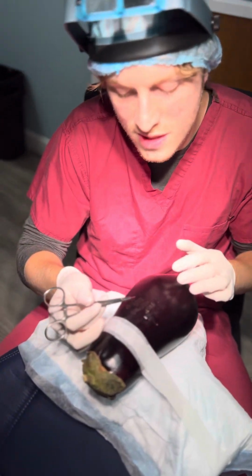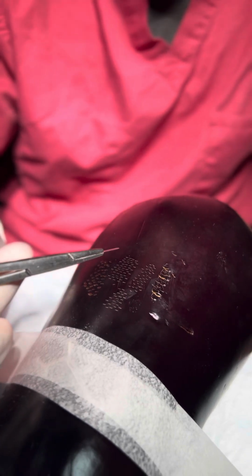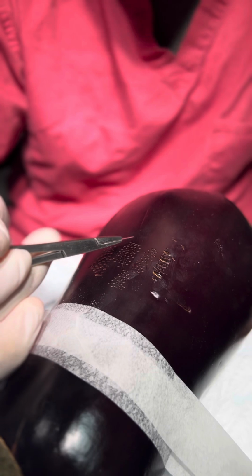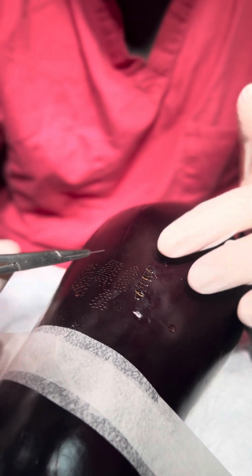So these are the incisions that we made using this one. This particular one is actually a 0.85 millimeter, but these incisions were made using a 1.15 millimeter blade. You can see they're much more uniform, much more symmetrical, much cleaner, and this is going to impact healing. It's going to impact the amount of bleeding, and bleeding gets in the way of making further incisions. If there's a lot of blood around because of things like this, then it's going to make it more difficult to make more incisions afterwards.